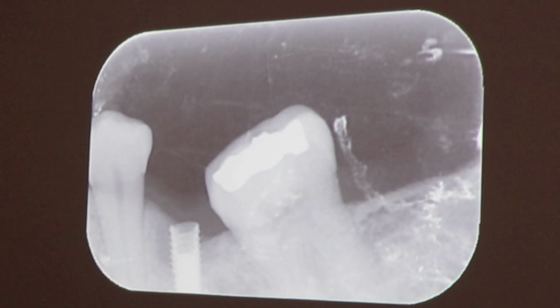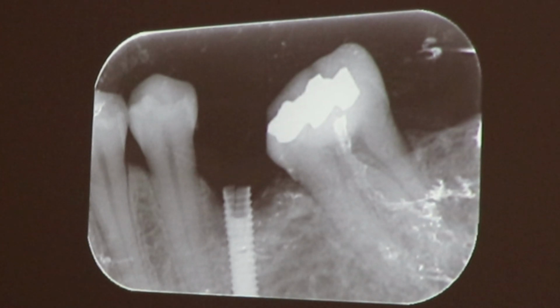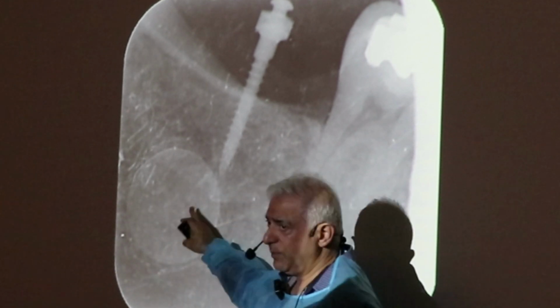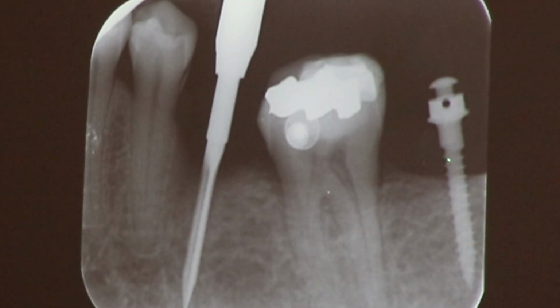As you can see, there is a small line of crack, and now we are thinking, okay, what to do? Removal is not the problem. Yes, we have to distalize, but as Dr. Sundar clearly said, it's not easy to move the molar in hard bone, and it's mandibular, not maxillary. So placing an implant behind the molar. This is flipped. When you see this circle, flip it in your mind. So we were able to upright the molar slightly until we can at least get a normal standard implant. And if we leave it, of course, it's going to go back. The tooth which is going to be here has just enough space for 7 millimeters.